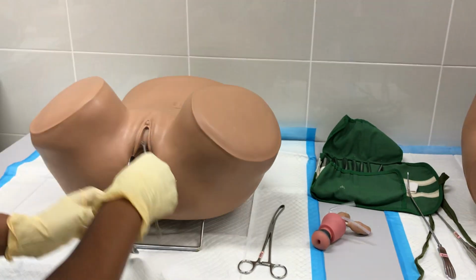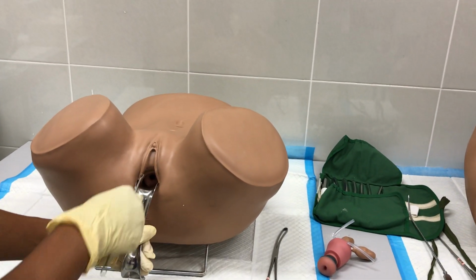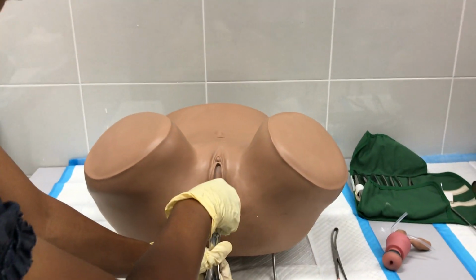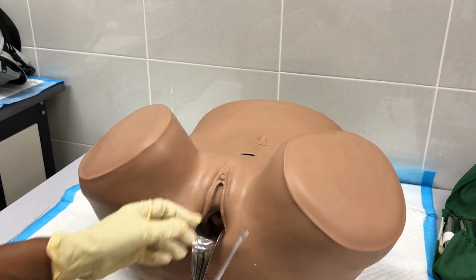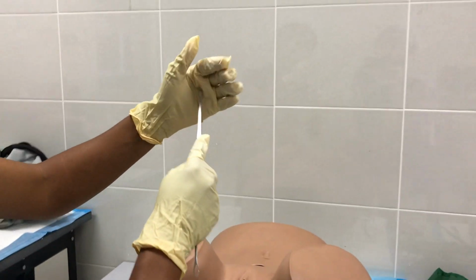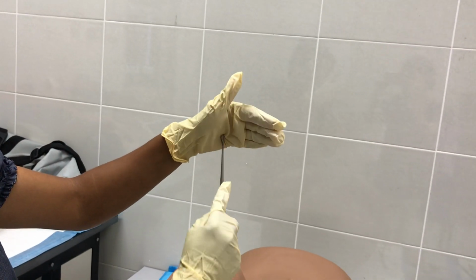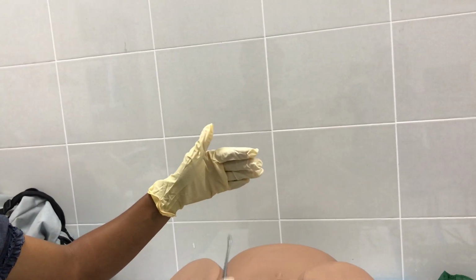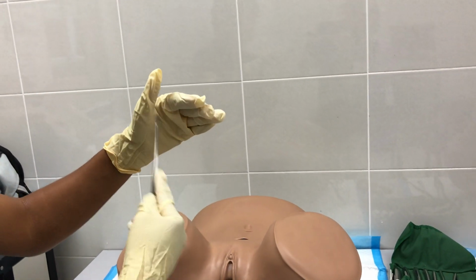Then after you finish that, you can put the gauze here, so that whatever tissue comes out will be collected onto the patient's same speculum. Then after that, you take it out and you put it in a specimen bottle. So when you do it, supposing this is the uterine fundus, you just try to scrape everything, all the corners in one go, not like going in, doing that and coming out, going in. Don't do that. Just go straight in and do all the corners, then it will be coming out.